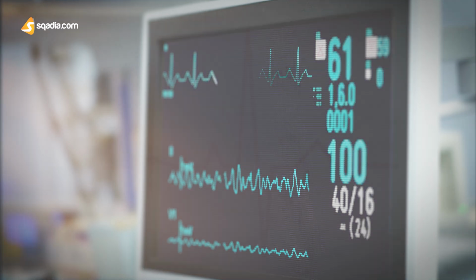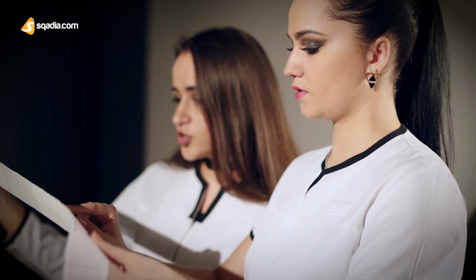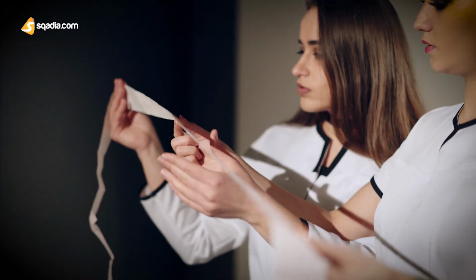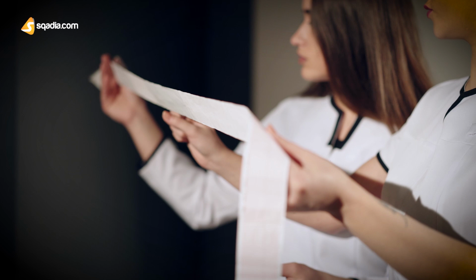Now, if you haven't seen our video on ECG basics, I suggest you take a look at that first so that this video will be easier to understand. Electrocardiographs, or ECGs, are very difficult to learn, especially because there are so many different findings that you could find. This video will take you through the most commonly asked ECGs that you should be familiar with and be able to recognize.